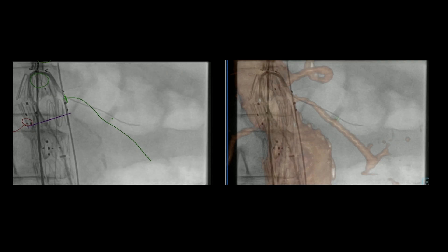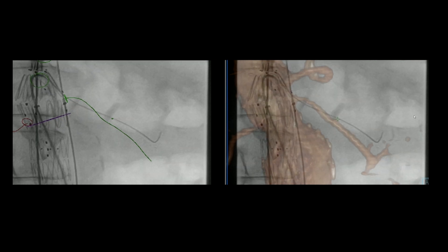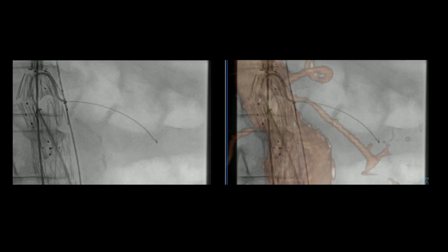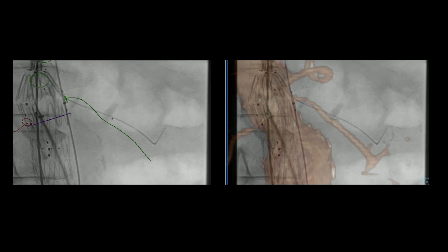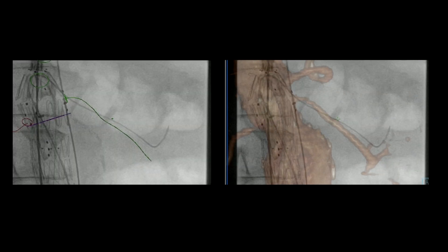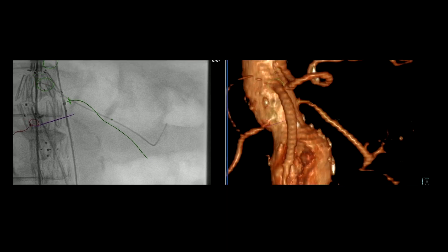Once you get the wire in, there's always some deformation of these arteries once you put devices into them, so that's why it doesn't completely align. But you get a good idea that it's going down the left renal artery. We brought the diagnostic catheter and wire up and over the top — it's hanging up on the fenestration. For that reason, we remove the catheter and replace it with a quick cross catheter, which will almost always reliably follow the wire. The quick cross is bounced off the still-enclosed apex of the fenestrated component. Once in place, we advance a Rosen wire, then replace the dilator for the sheath and advance the sheath over the Rosen wire into the left renal artery.